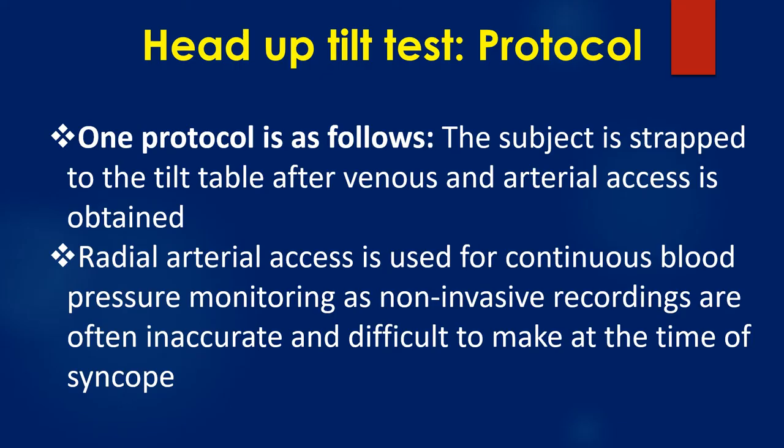The subject is strapped to the tilt table after venous and arterial access is obtained. Radial arterial access is used for continuous blood pressure monitoring, as non-invasive recordings are often inaccurate and difficult to make at the time of syncope.